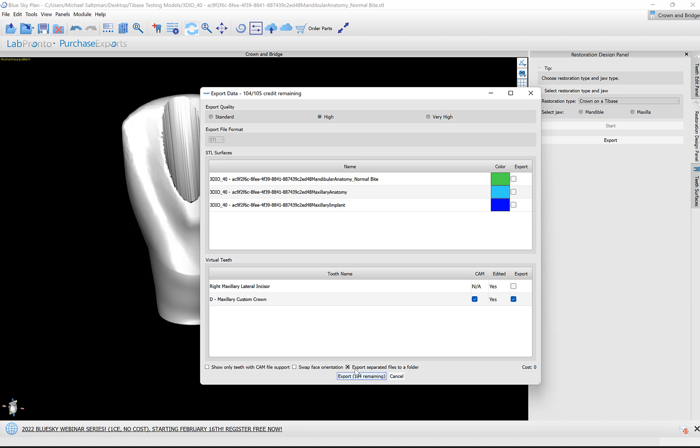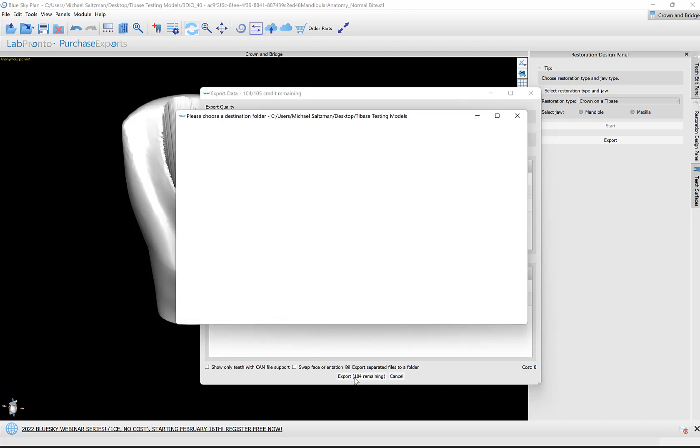We have automatically activated this option to export separated files to a folder. Just to explain that very quickly: if you're just exporting one file, then you could toggle that on or off and decide where you're saving that particular file. If you're exporting multiple files, then it will be toggled on by default. The idea is simple—just to export the multiple files to the same folder. I'm going to click Export.